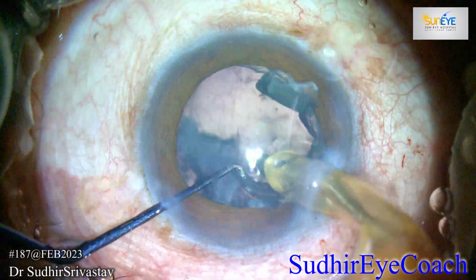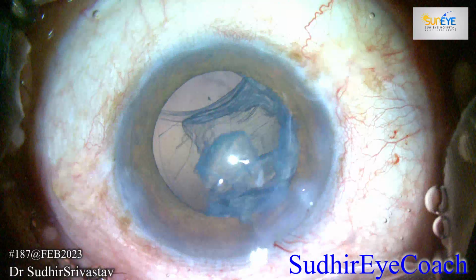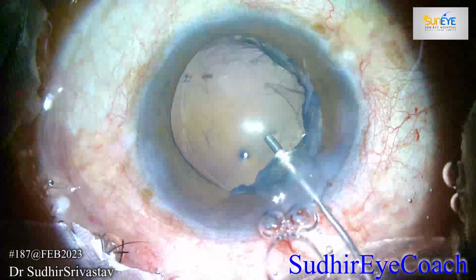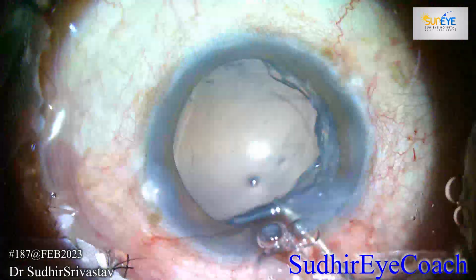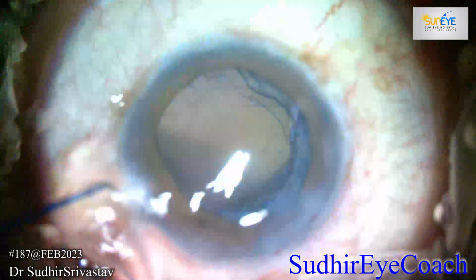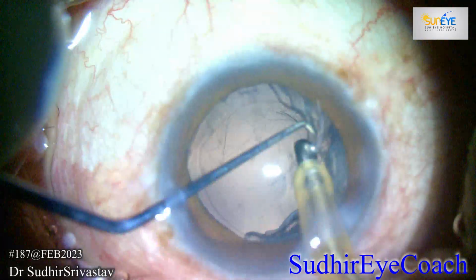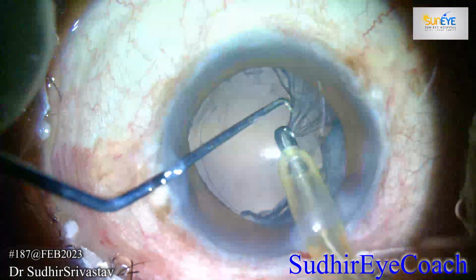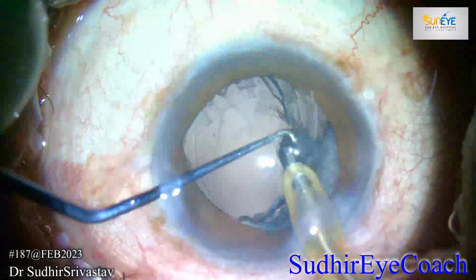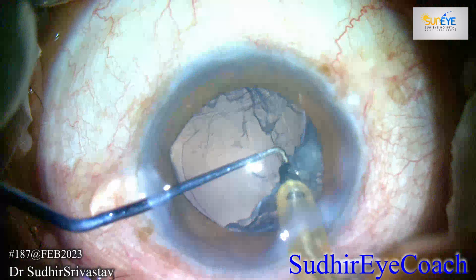Many thoughts were coming to my mind, whether to put a CTR to support the bag or keep the IA tip away from the area of dehiscence so as not to catch hold of the vitreous. I kept on injecting viscoelastic to retain the bag in place, and luckily the cortical matter was limited and it was in the area where the capsule support was fair and strong. So with lower pressure settings, I continued to remove the cortical matter.